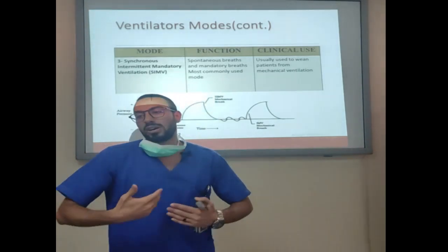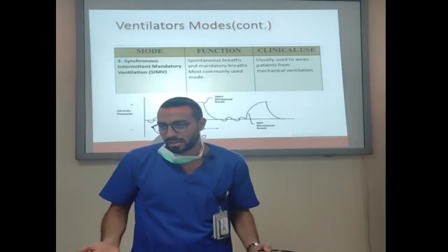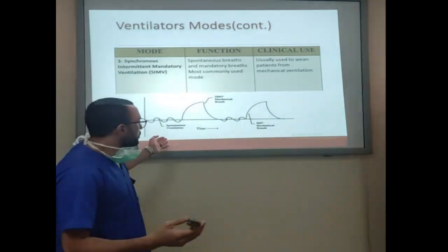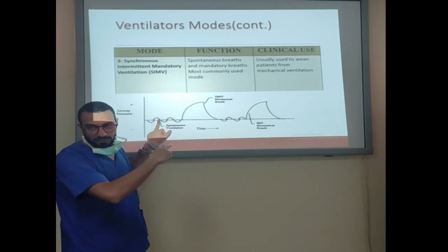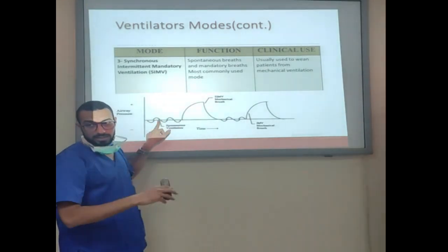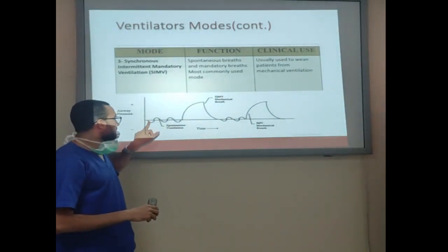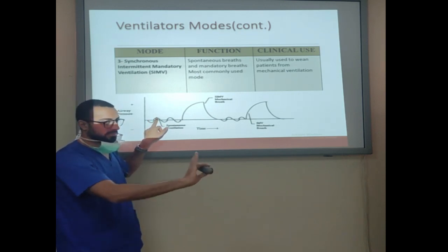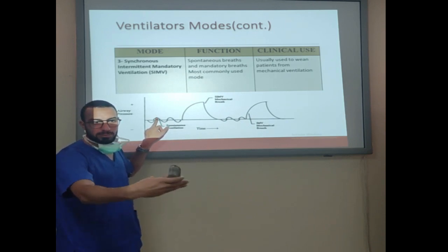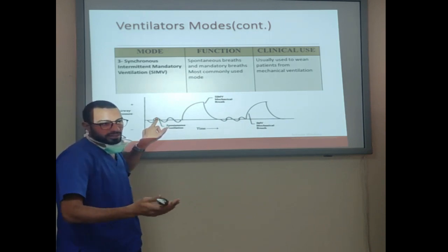Trigger the vent is to try to have a respiration. So the patient will begin like this, and this is the difference between this one and the previous one. We have here the SIMV. The patient is trying himself, and the ventilator will leave him alone trying. It will not support him. It leaves him just to train.